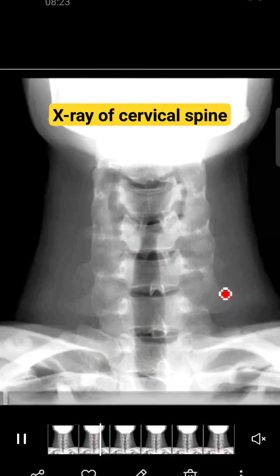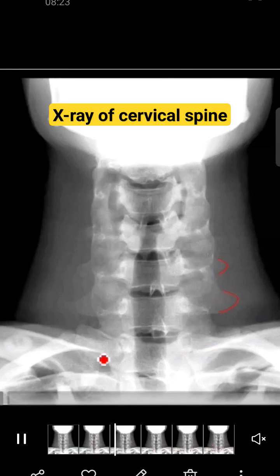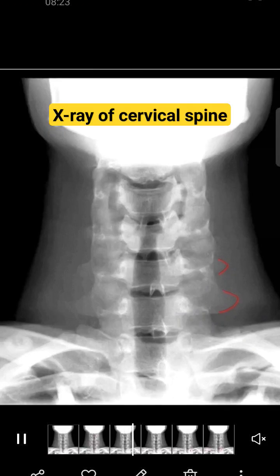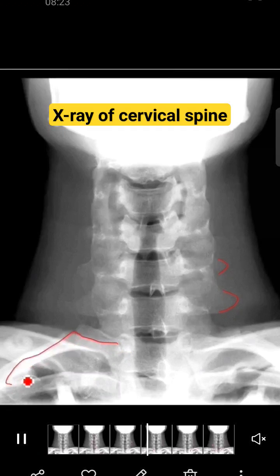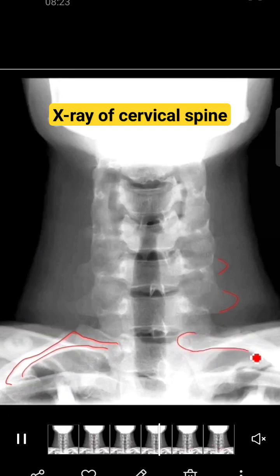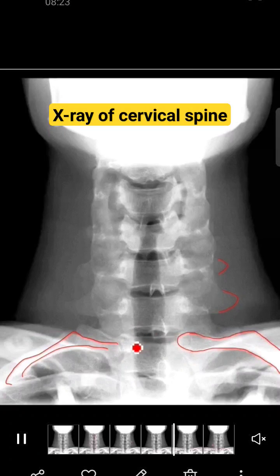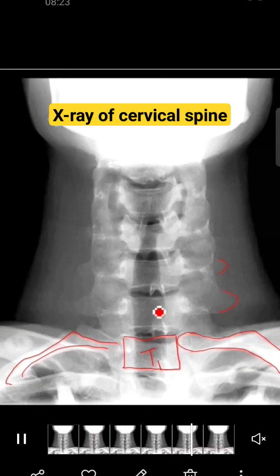To identify these projections, you first need to identify the number of vertebrae. For that, we will go and identify the attachment of the first rib. Here you can see this is the rib on the right side and this is the first rib on the left side. As you know, ribs always attach on the thoracic vertebrae, so this will become T1.